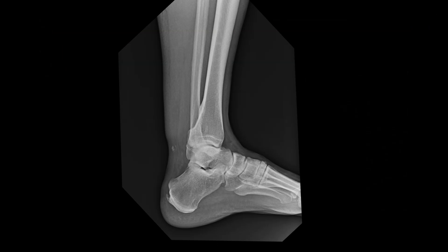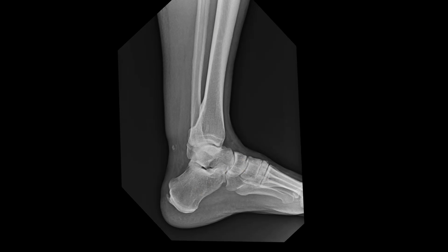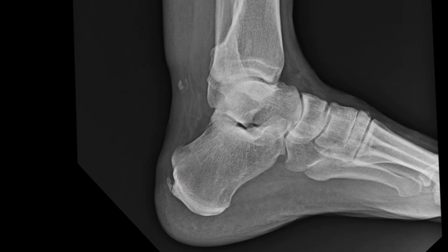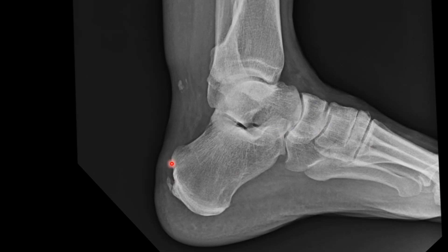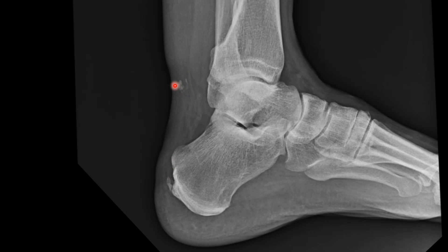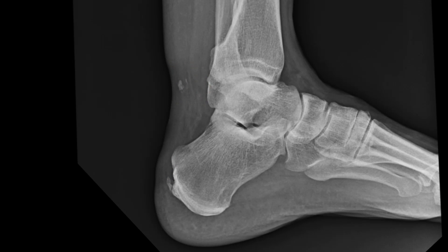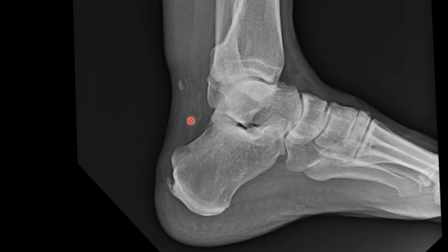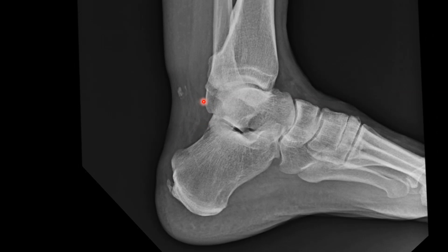Here's the patient's comparison ankle x-ray — a lateral view showing an exaggerated plantar arch. We see some posterior enthesiopathic spurring at the calcaneus where the Achilles tendon attaches, as well as calcification more superiorly, which is what we saw on the previous ultrasound image. This is the area of the Achilles tendon — you can see it's a little thickened, and we have edema within Kager's fat pad.